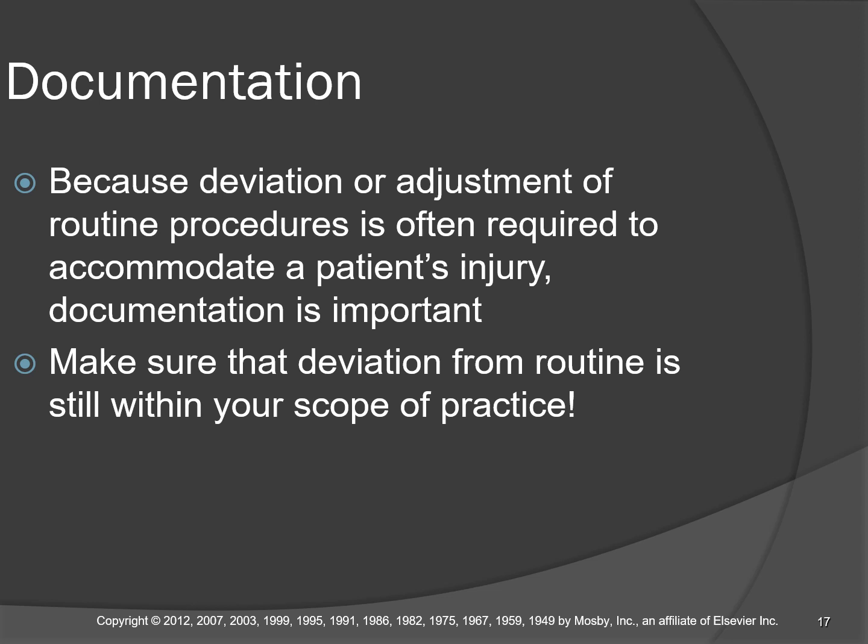all right, documentation. Sometimes you're going to be deviating from standard positioning and standard protocol because of the nature of the patient's injury. Okay. If you're deviating from routine, make sure, first of all, that you're within your scope of practice to do so. Second of all, document what you did differently and why you did it differently.